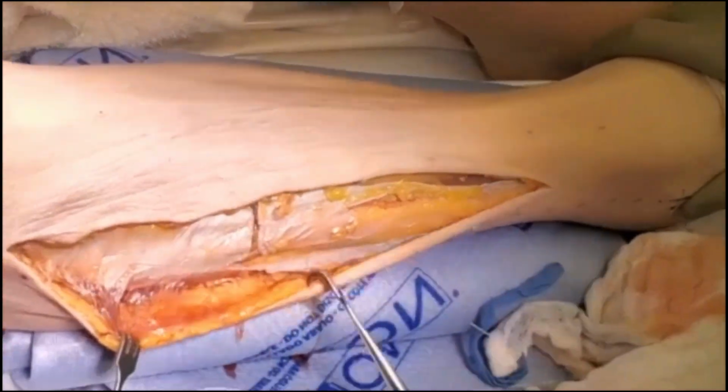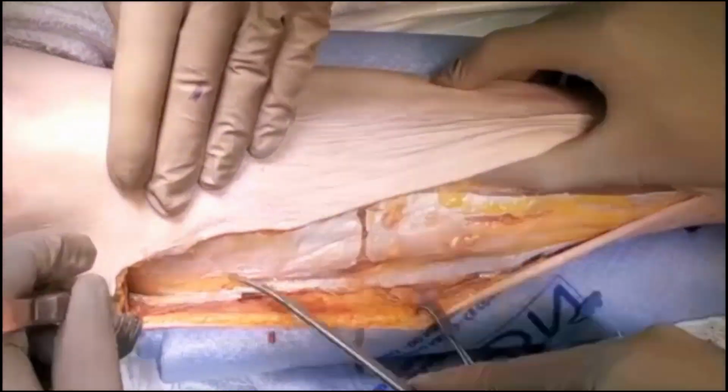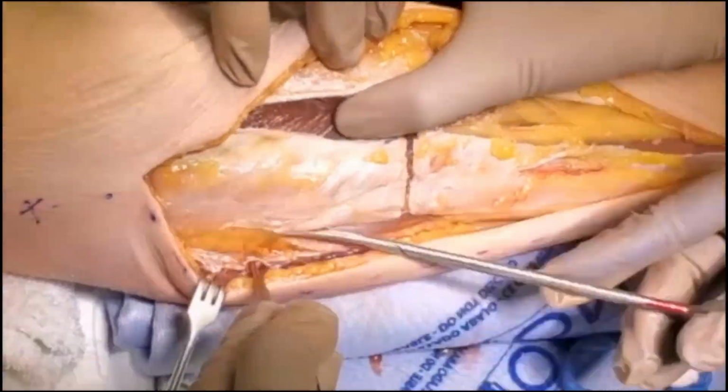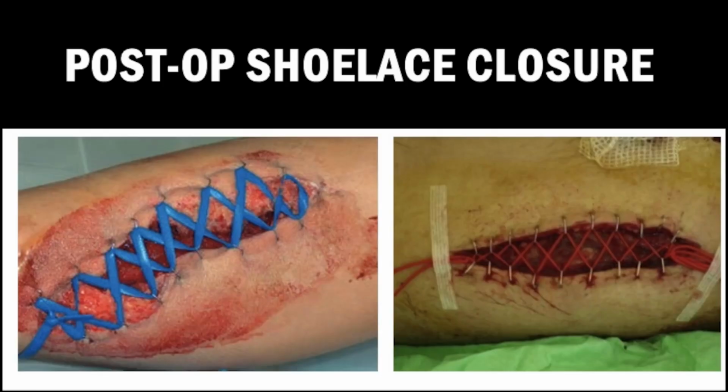Make sure to open the compartments along the full length of your skin incision to prevent the fascia from acting as a constrictor band. After the procedure is complete, do not close the wounds primarily. Leave them open for a minimum of 48 hours. Cover with sterile wet-to-dry dressings that are changed regularly, and consider a shoelace closure.